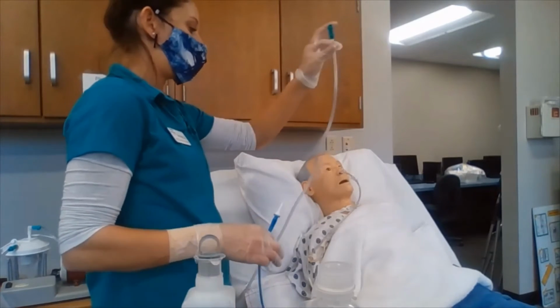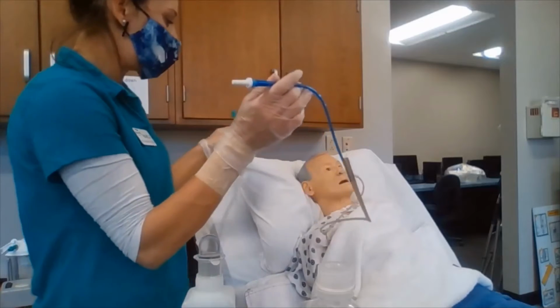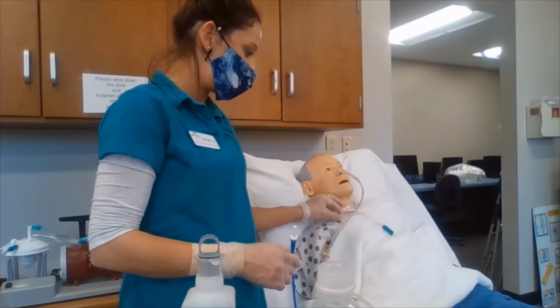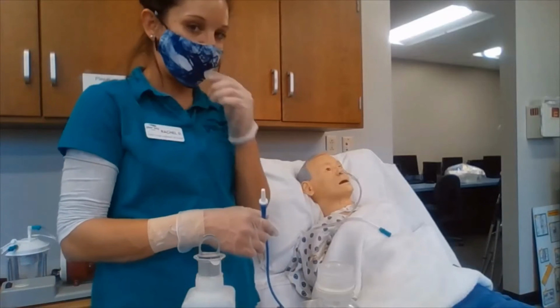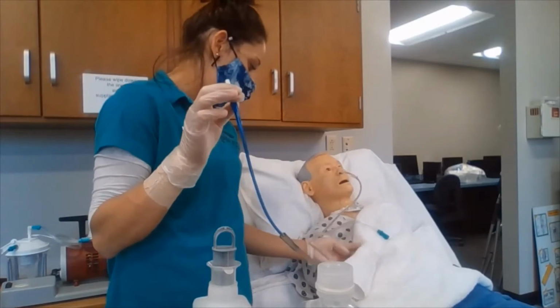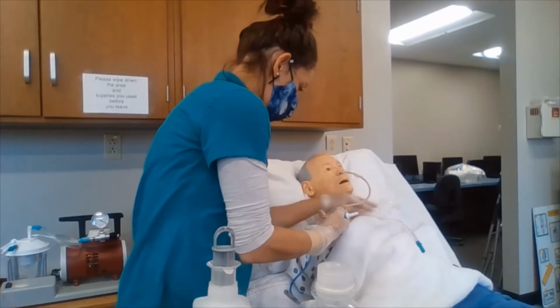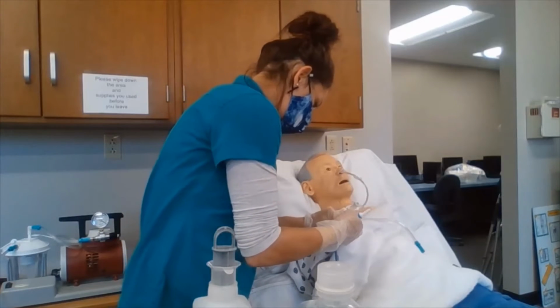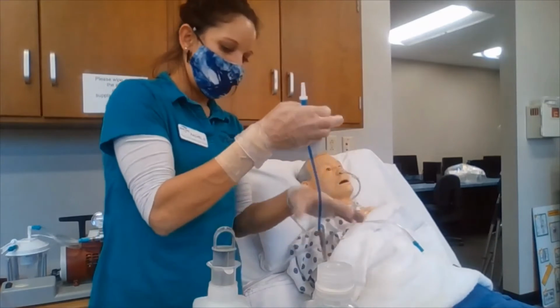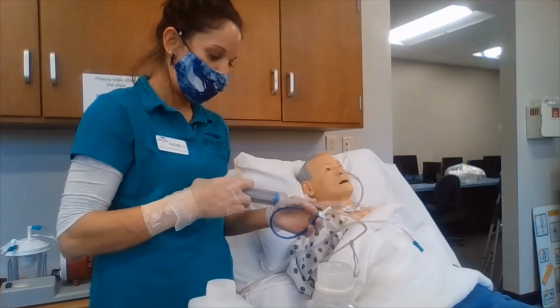Going then to be holding the suctioning tubing up so then all the secretions can filter into our canister. We can either place it on the patient's pad, or we can put it back on our suctioning machine, hanging it over our suction machine. After that, we can then unclamp it, and then we are going to be unhooking it from our safety pin. And then we can then go ahead and put in our solution.